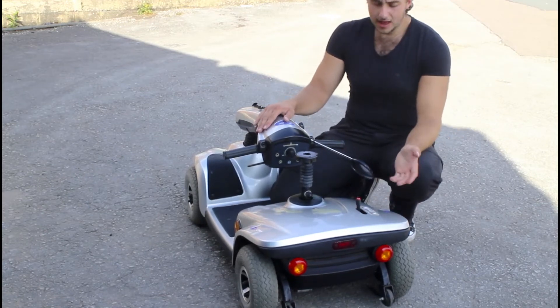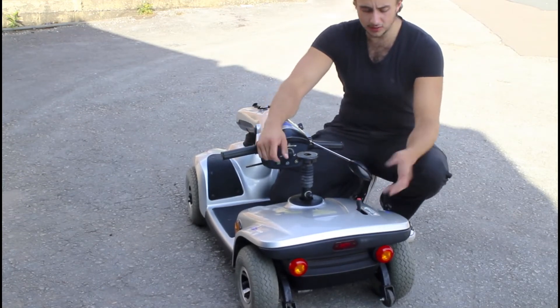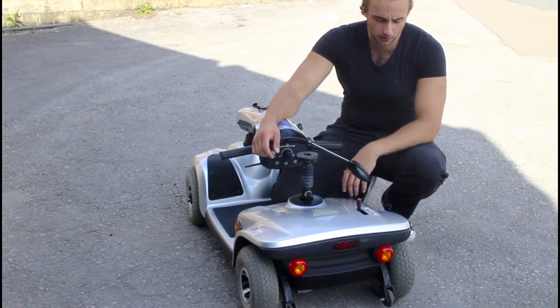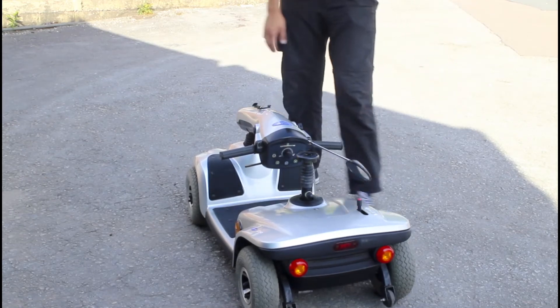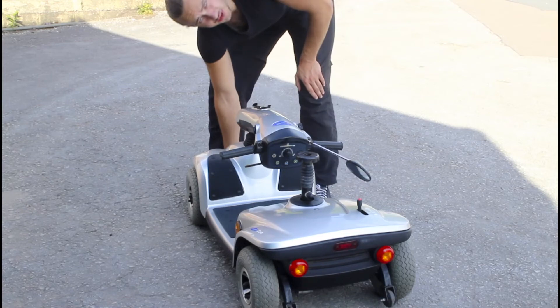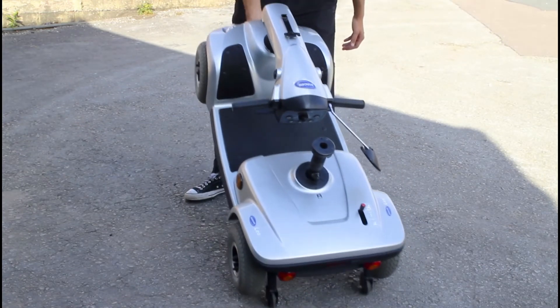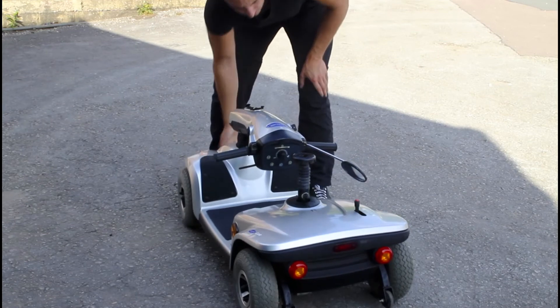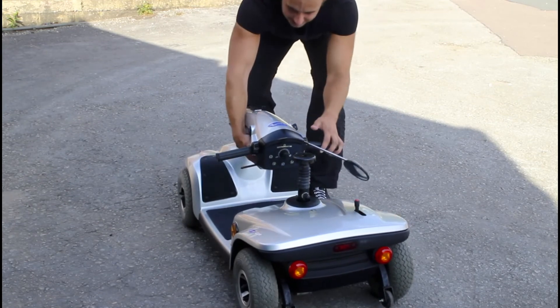I'm going to make another video on how to get a scooter of this size into something like a hatchback, because it's possible — we've done it many times. If you want to transport this with the handlebars down, there's always a handle at the front. Lift that up and it's easy to transport.